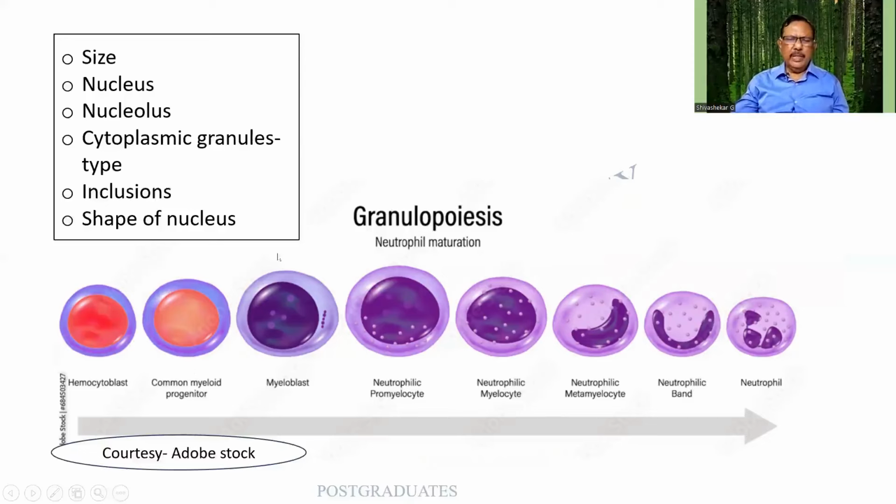So this can sometimes lead to a leukemia. You find something like an undifferentiated leukemia. Let us forget that. After this, we have got the series of the neutrophilic cells: a myeloblast, then a promyelocyte, myelocyte, metamyelocyte, a stab form, and then the matures. In this one, the myeloblast can be either granular or agranular. Usually I say it is agranular. It has got a large nucleus, prominent nucleoli, 2 to 5 in number.